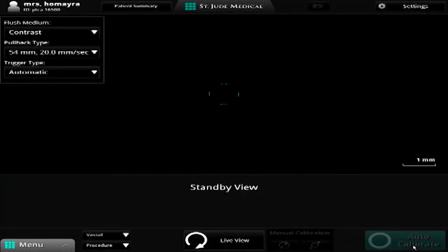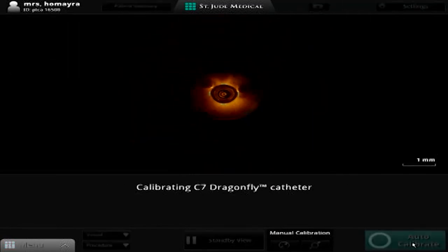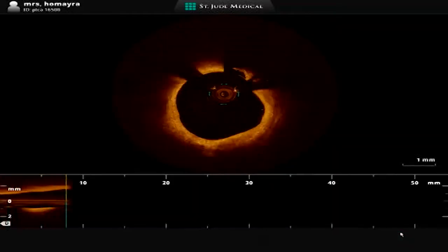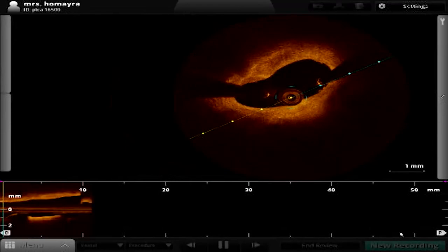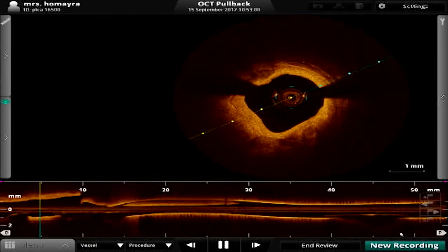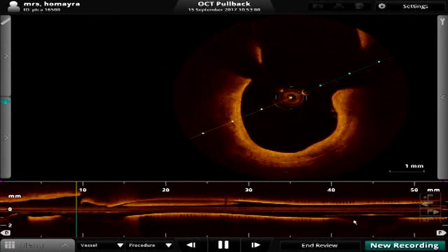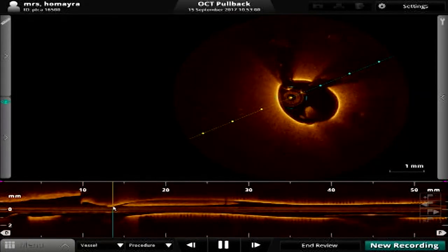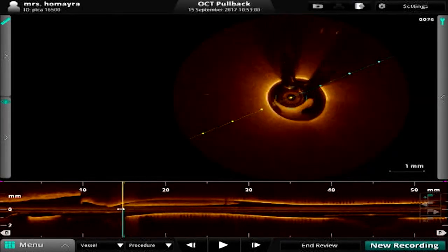Maybe an additional point, our worries come from the Absorb stent BVS, which has a much larger profile, and Merez has a much more favorable profile. Yeah, I was actually impressed how the BRS tracked on that diagonal. It's much more trackable. So we have done another OCT. I think you can see the images there. The proximal segment looks like 3.25, something like that. Just go distally now.